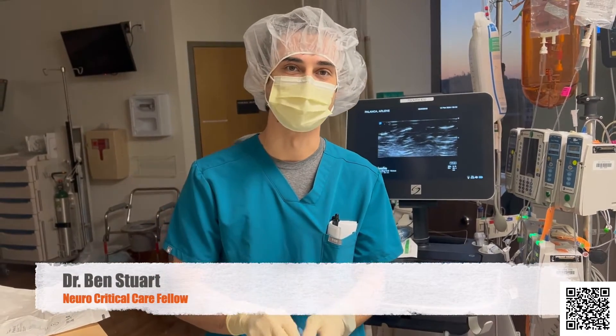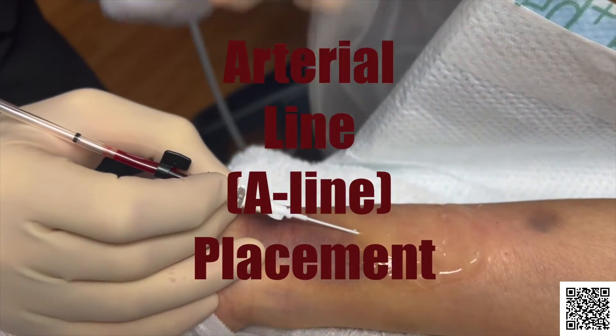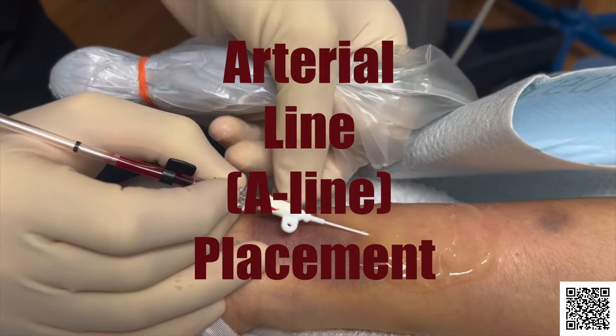This is Dr. Stewart and this is how we do it. Arterial line placement.